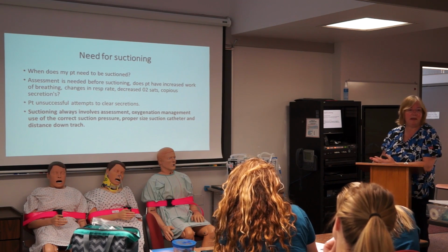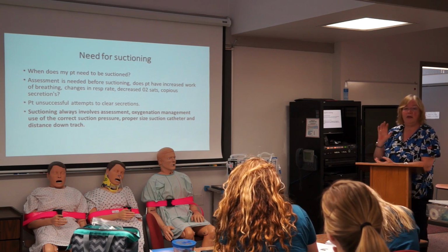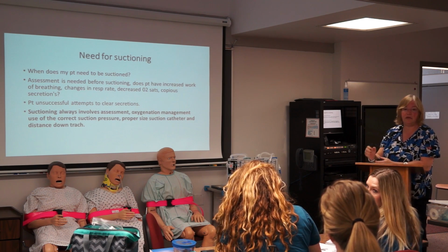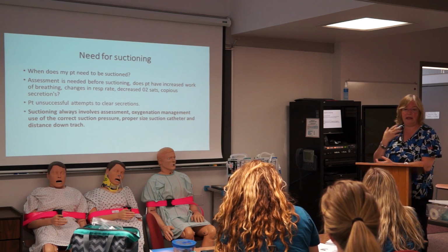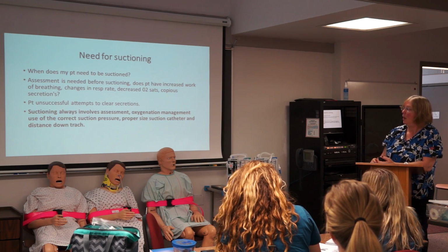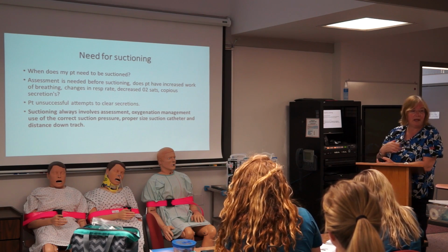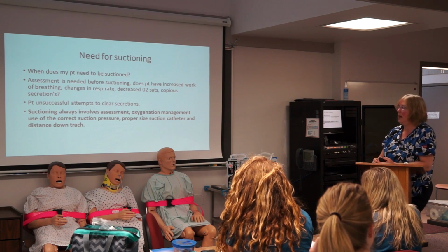Copious secretions are mainly going to be for the patients that we have here set up in bed 4 and bed 5 that are not on a ventilator. Because they don't have any pressure of ventilation forcing down those secretions, when they cough real strongly, they can a lot of times bring those secretions up by themselves. Okay, is the patient having unsuccessful attempts to clear the secretions? A lot of times our patients are awake enough that we can have them try to cough and then we can easily suction them out.